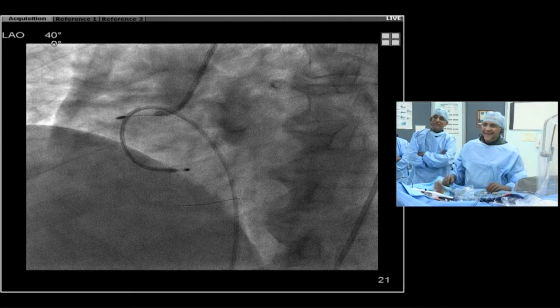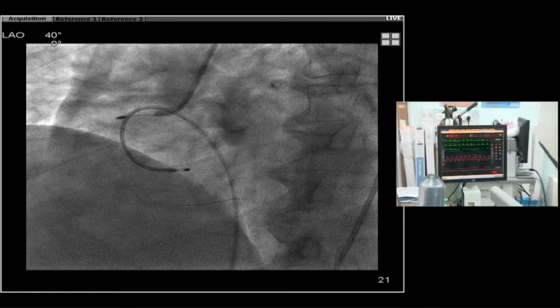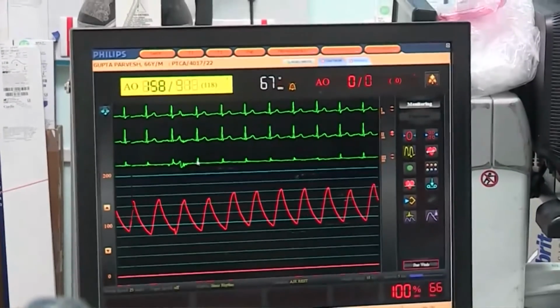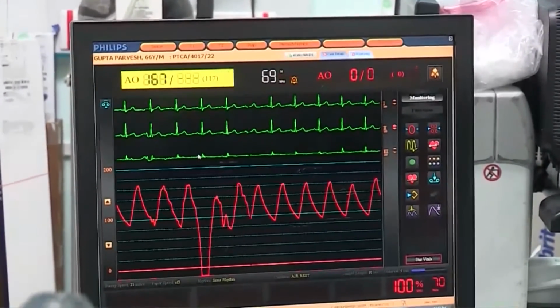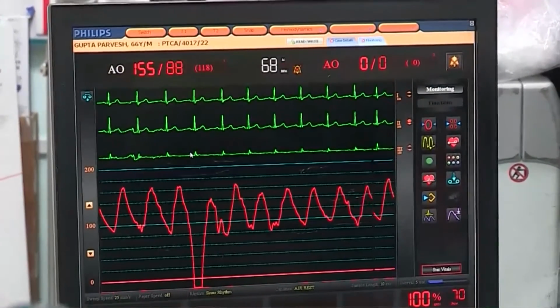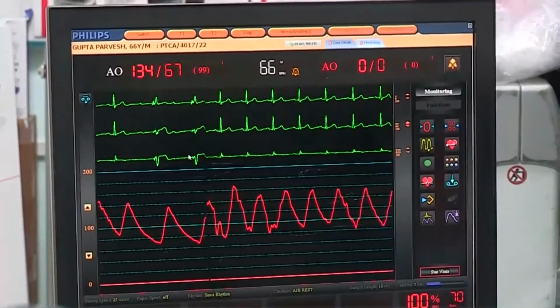Actually, there is a newer version, RotaPro. You should start using it because hand-leg coordination is a problem. RotaPro has just a button, you press it and then you keep moving the burr. So it's slightly more user-friendly, but if you make it too expensive, it doesn't work. They have come down on the price now in the country too. For us, they just increased the price and took the old one off the market.